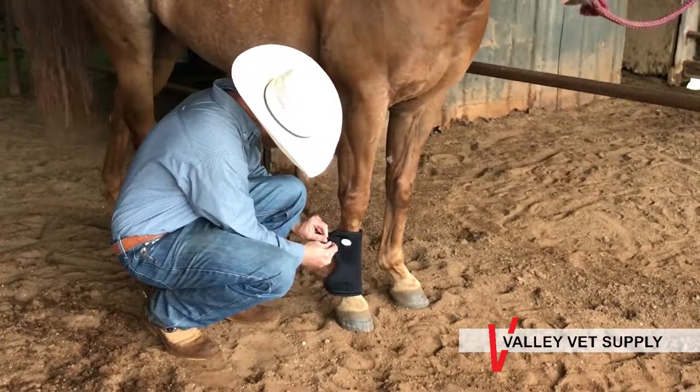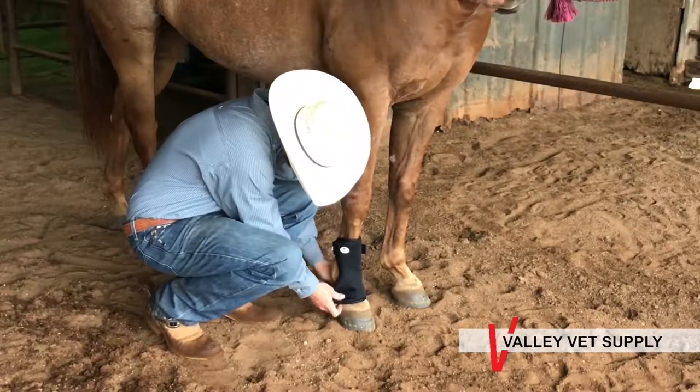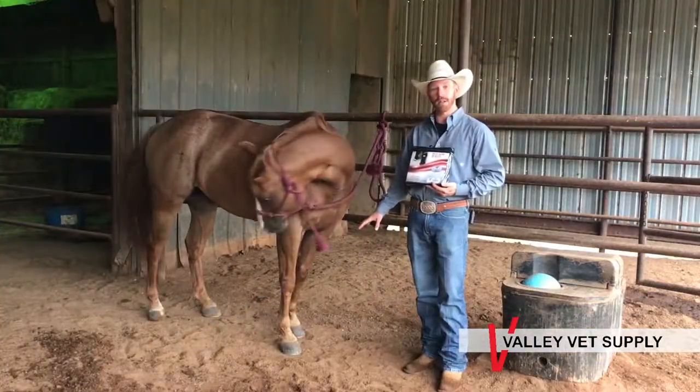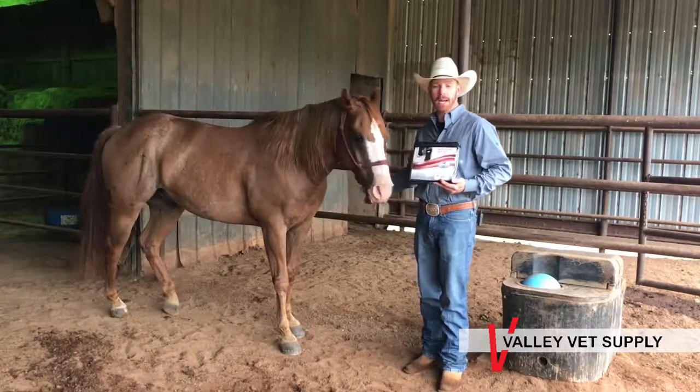They protect from bedsores when your horse is laying down. If you have an older horse or a horse that's injured, or maybe just a horse that lays down a lot, that's going to get sores on the front of their fetlocks, maybe the front of their pasterns — these boots are exactly what you need.